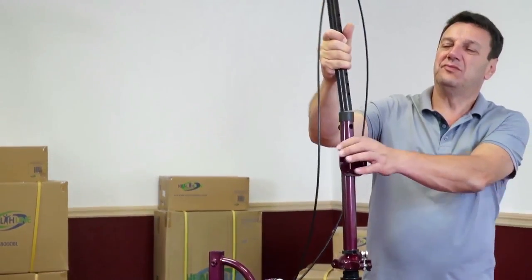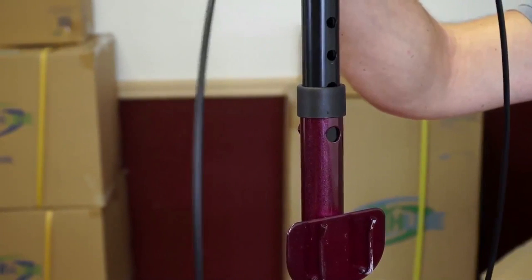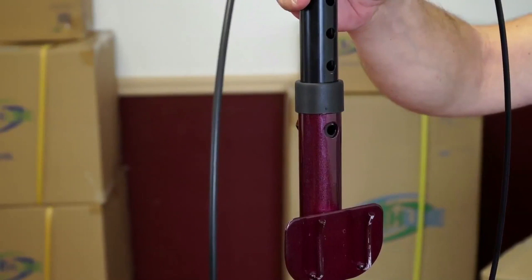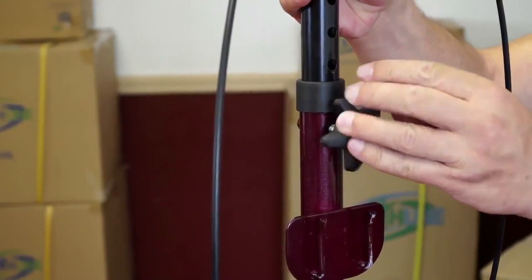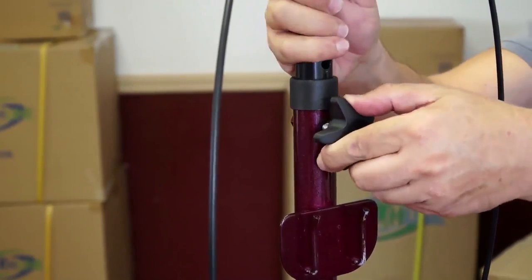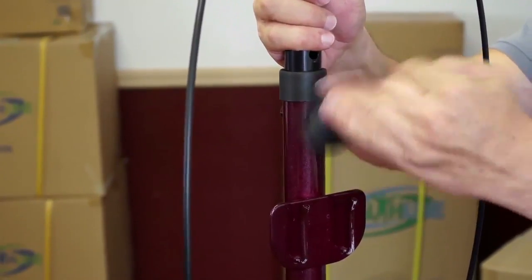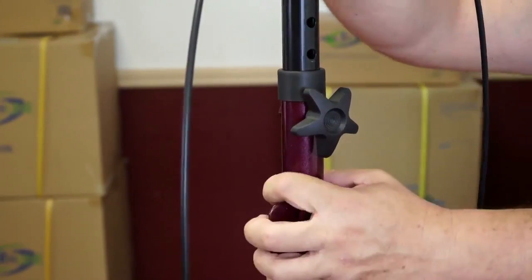Insert the stem of the handlebar assembly into the head tube. Align one of the holes on the stem with the hole in the tube. Choose any hole for now — you can adjust the height of the bar by choosing a different hole once the scooter is fully assembled. Secure the handlebar with the large bolt, feeding it from the front through both the hole in the tube and the stem as seen on the video. If done right, the bolt will screw straight into the nut welded to the other side of the tube. The handlebar is now secured.